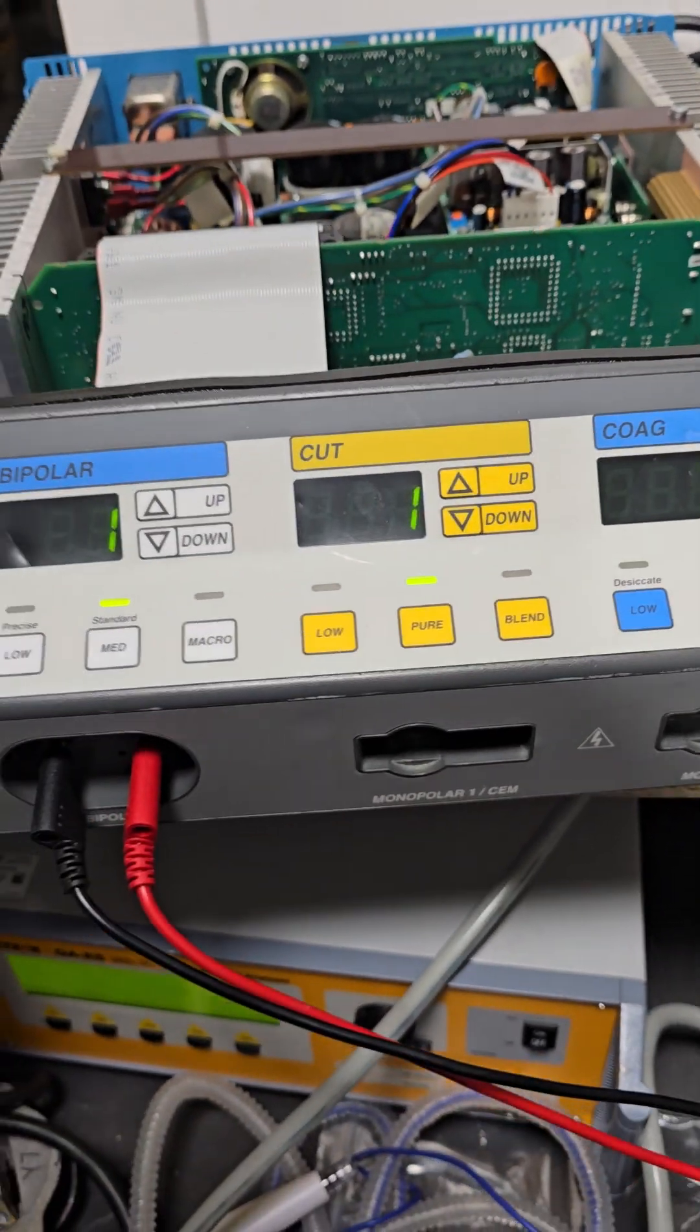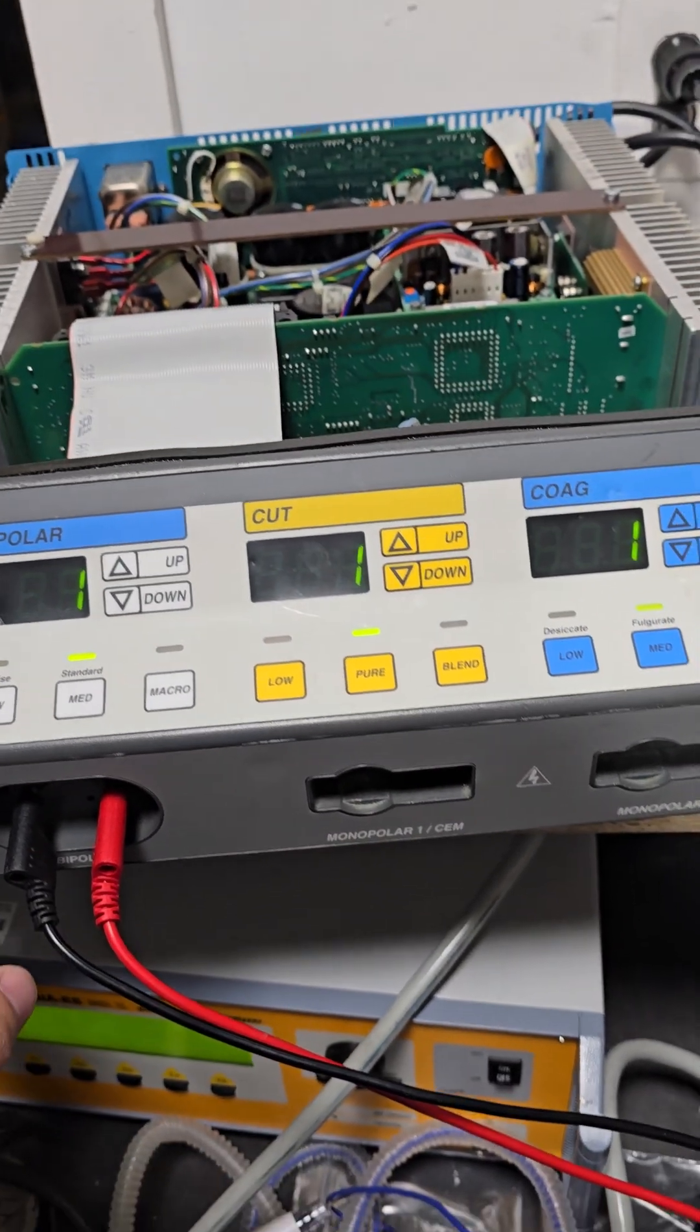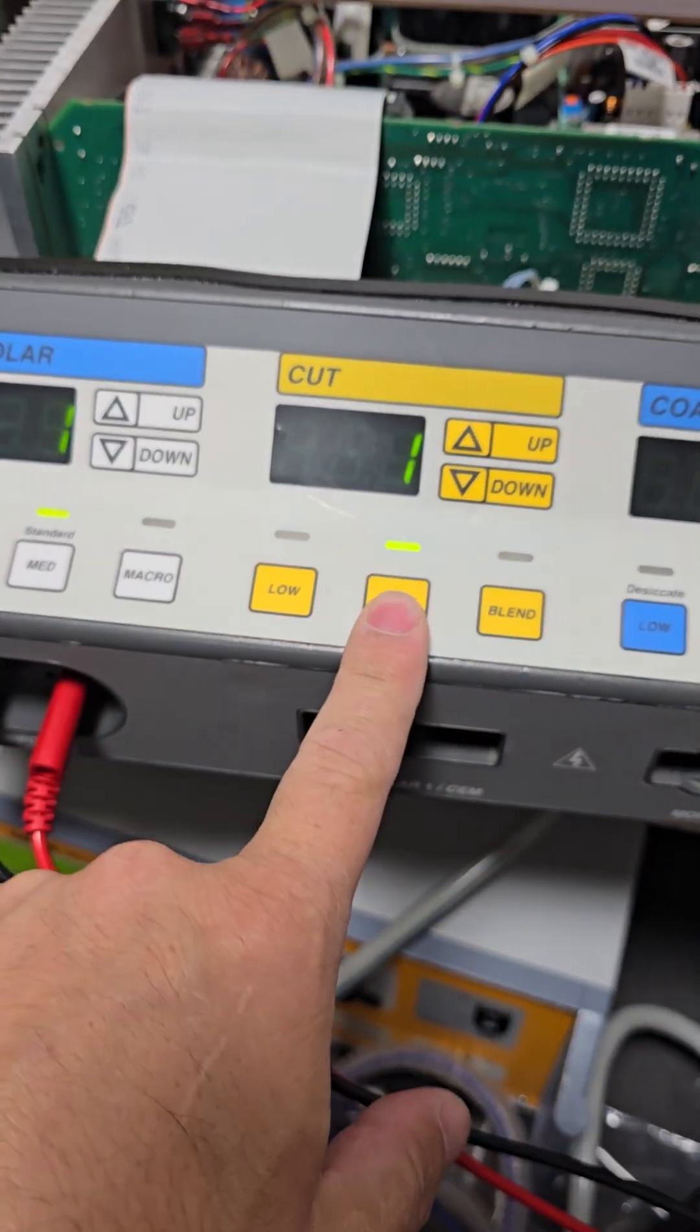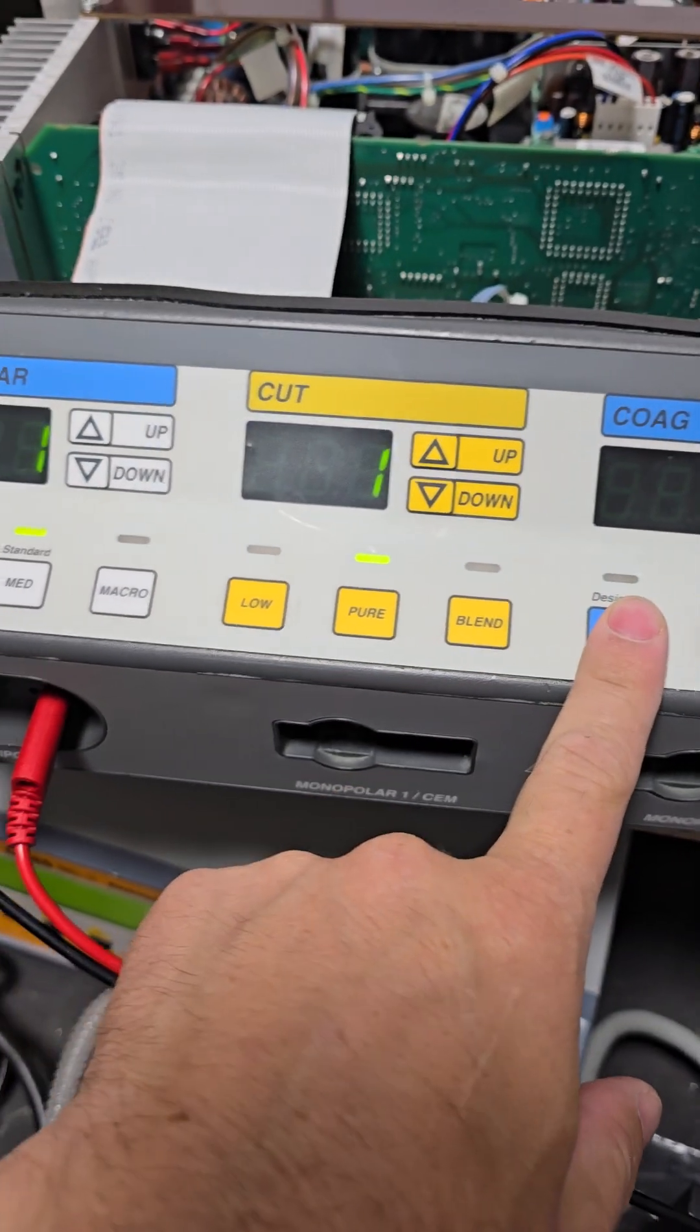Alright, that is self-test LED. Next step to get into calibration mode, we're going to hold down the Recall, Cut's Pure button, and Coag's Low button.